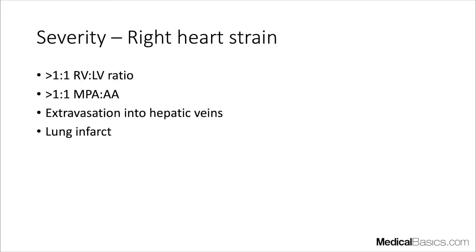Other findings include the main pulmonary artery to ascending aorta ratio: if the pulmonary artery is bigger than the ascending aorta (ratio greater than 1:1), you can consider right heart strain. A very nonspecific finding is extravasation of contrast into the hepatic veins via the IVC. Separately, as things progress, you can have infarction of the lung — a complication rather than a direct marker of right heart strain.